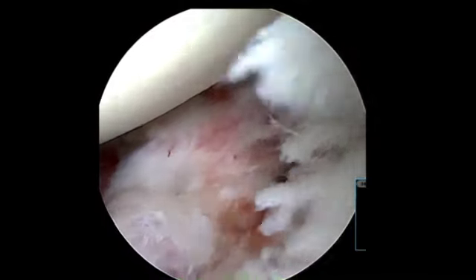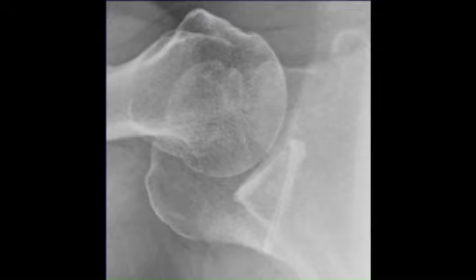Postoperative radiographs demonstrated satisfactory glenoid fracture reduction using 2 cannulated screws by way of the Halifax portal.